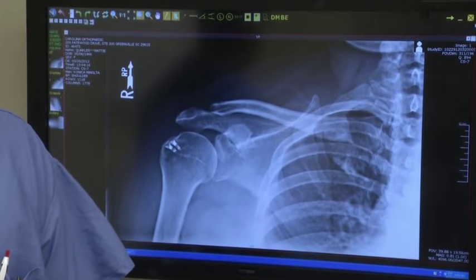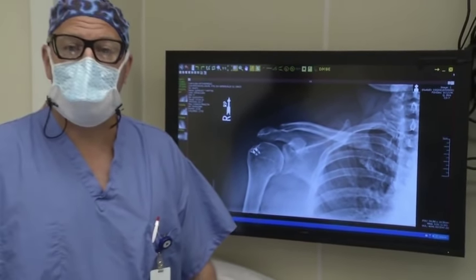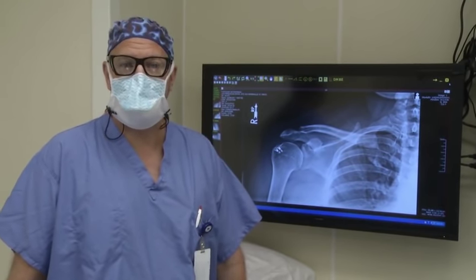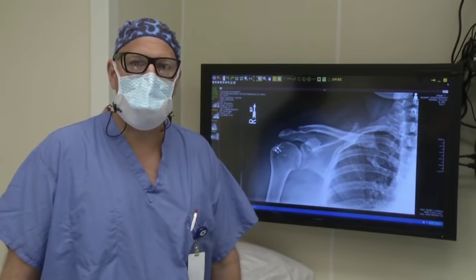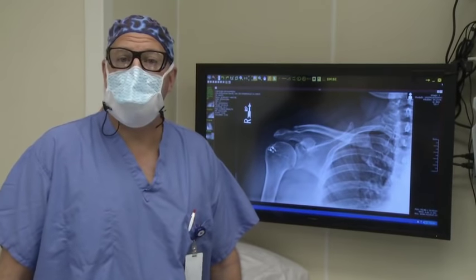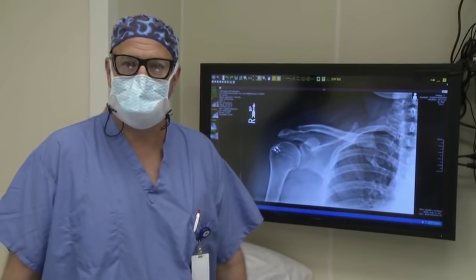After surgery, she's developed a sore, painful, stiff right shoulder, which has not responded to non-operative treatment, which has included medications, injections, and physical therapy. And this morning, we are going to manipulate her shoulder and perform an arthroscopy of her shoulder to try to alleviate some of her discomfort and, more importantly, to improve her motion and overall function.